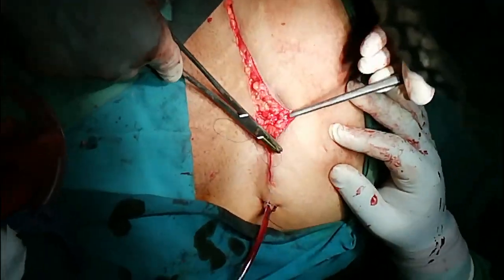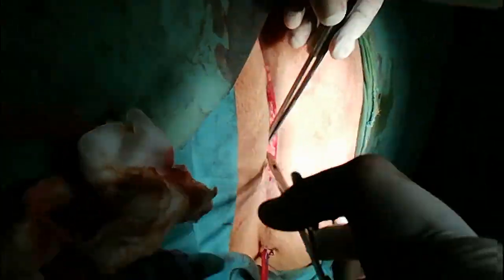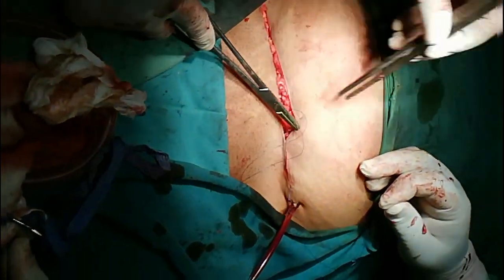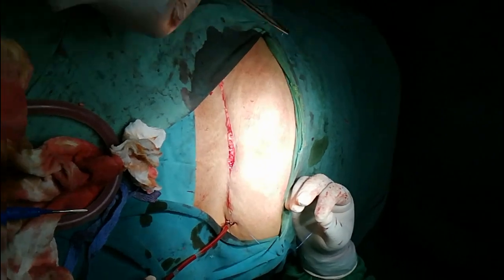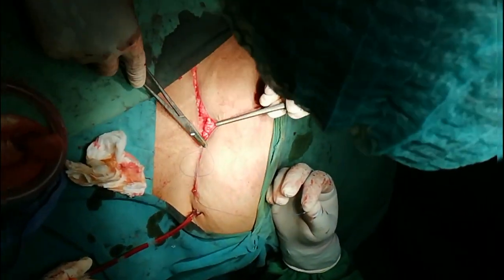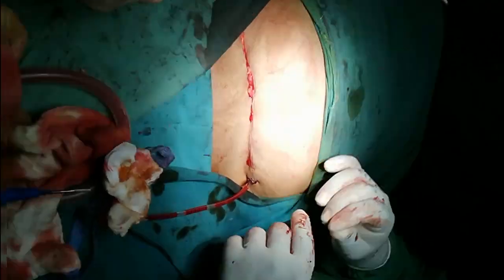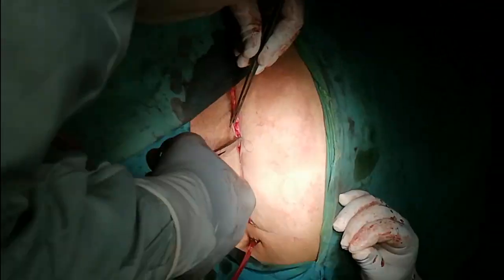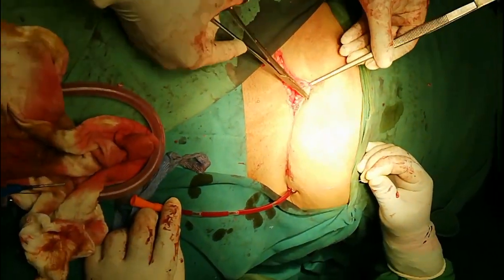After closing the subcutaneous tissue, we will perform skin closure. You can use skin stitches or absorbable subcutaneous stitches. The wound should heal well with approximated edges. If there are ragged edges, mattress sutures can also be applied. We are applying subcuticular stitches with Prolene 2-0 for skin closure.